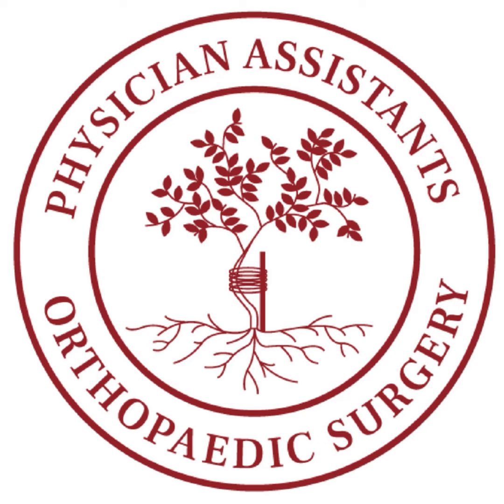In terms of using planes, it's sort of a tricky question, because in general, whether or not MRIs perform these planes or include these planes when you order a study, the answer is a general yes, but it's important to know where MRI protocols are designed. And MRI protocols for musculoskeletal imaging are typically designed by the responsible musculoskeletal radiologist. If there's no musculoskeletal radiologist, then a general radiologist may do it, or they may copy it from articles or copy those protocols from institutions. Most protocols in general have three planes. In my opinion, we should always have three planes in MRI MSK protocols.